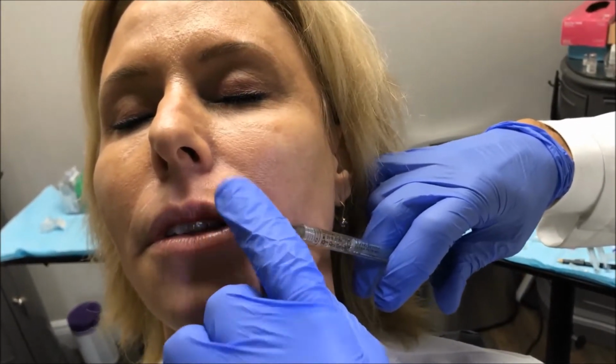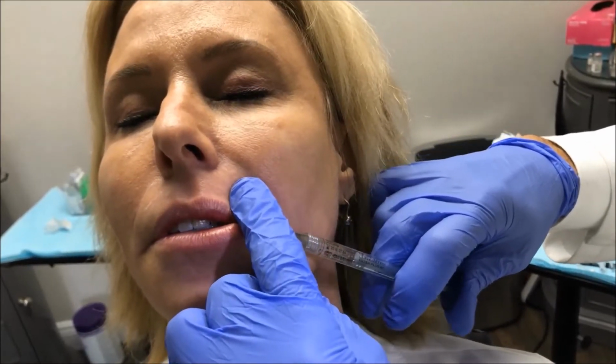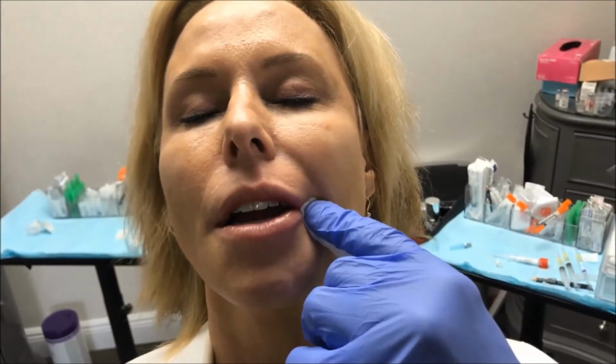Same thing now, my goal is to be right here. You can kind of see the tip of my micro cannula. There we go. Nice. Just a little bit of volume. It kind of lifts the upper lip so we see more upper lip show, but without overdoing. Now close. Okay. Great.